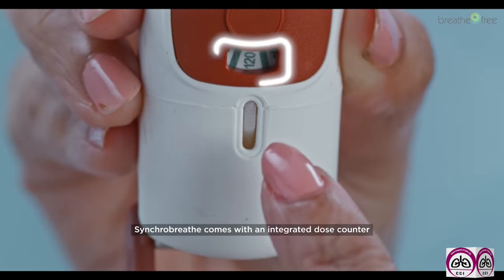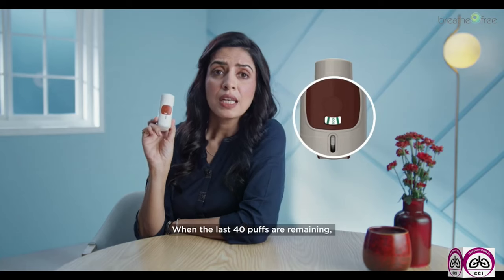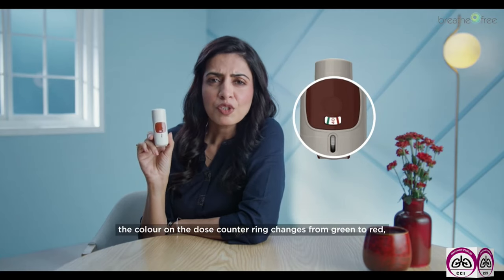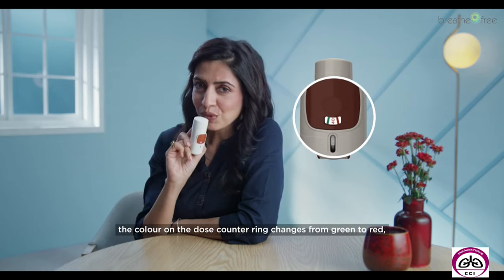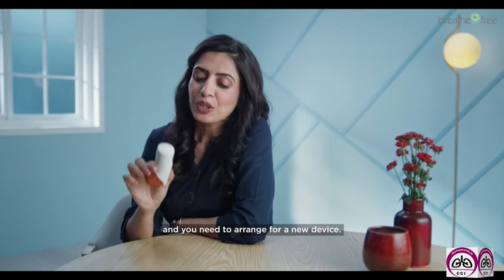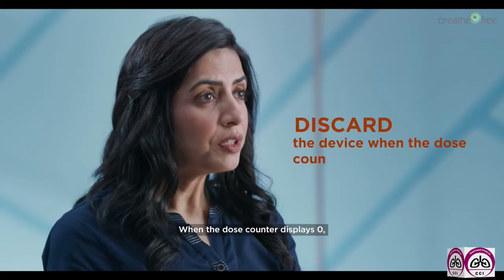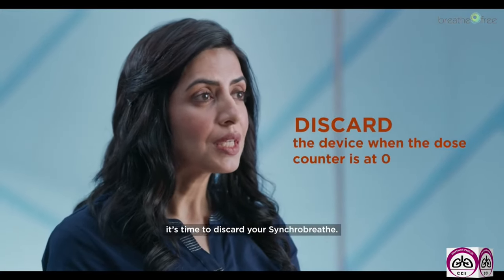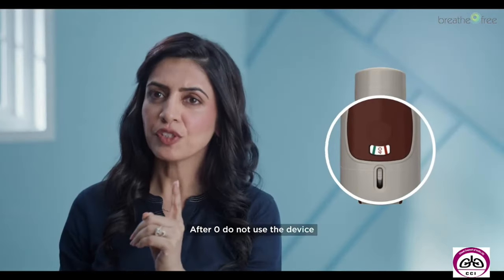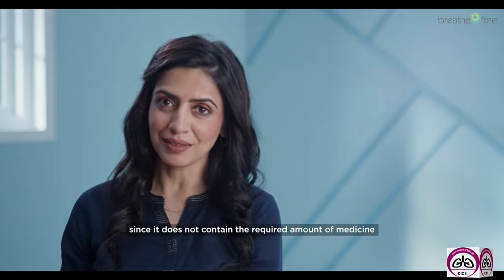SynchroBreathe comes with an integrated dose counter, which moves at the interval of 20 puffs. When the last 40 puffs are remaining, the color of the dose counter ring changes from green to red, indicating that only a few doses are remaining. And you need to arrange for a new device. When the dose counter displays zero, it's time to discard your SynchroBreathe. After zero, do not use the device since it does not contain the required amount of medicine.